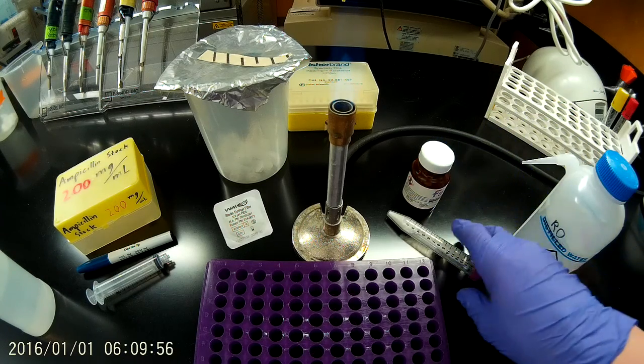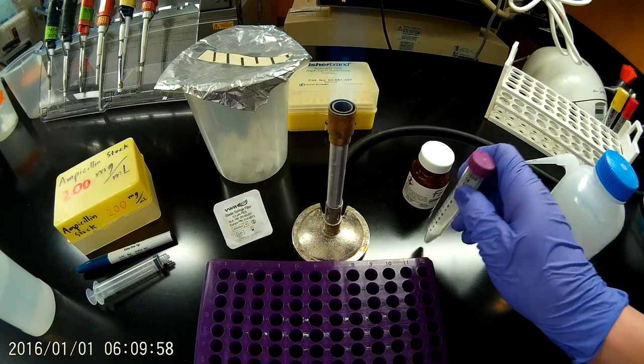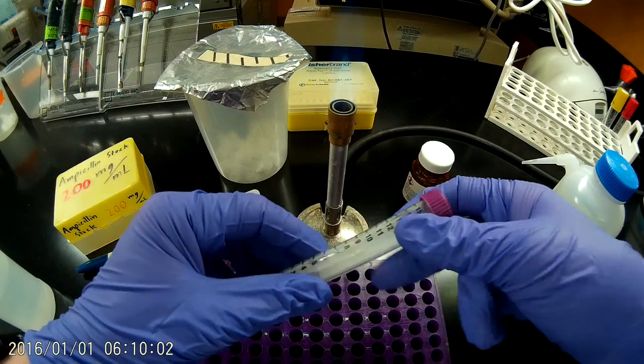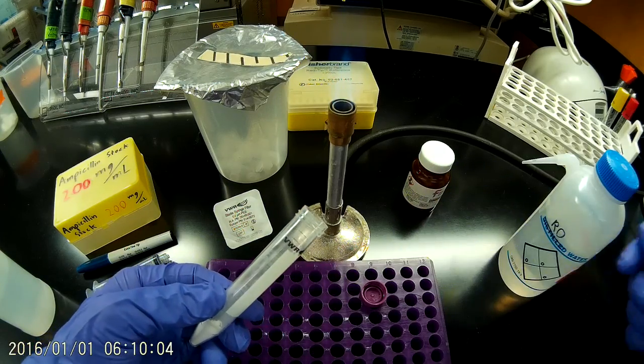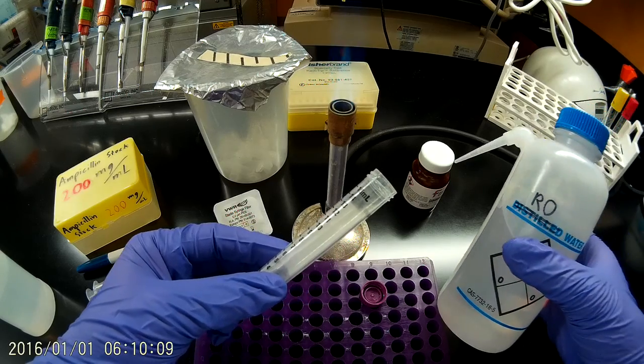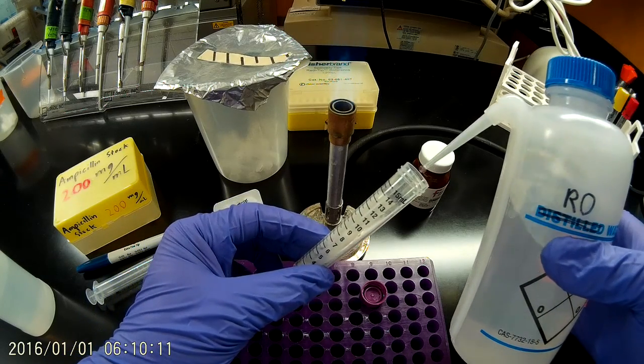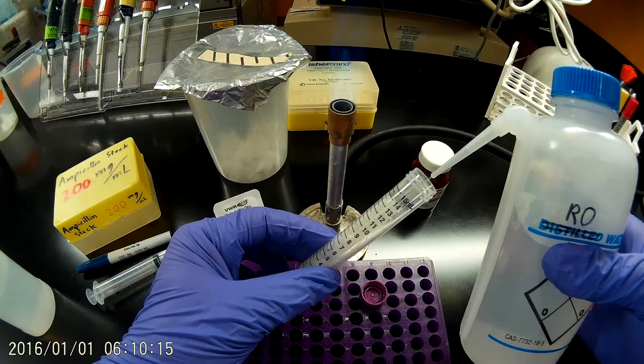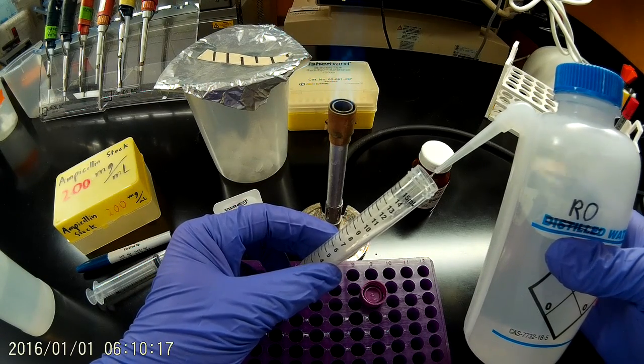So I took that out, I weighed out 2 grams of ampicillin powder, and now I'm going to add water to that. We're not working sterile yet, even though I have the flame going. I'm going to add millipore water to this, about to a volume of roughly 9 mils.